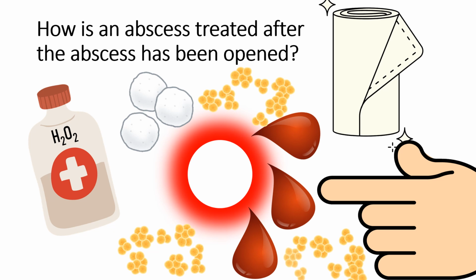Sometimes arterial bleeding may occur from the skin or subcutaneous tissue. It is stopped by suturing with catgut. Tampons are usually inserted with a hypertonic solution or dry. An antiseptic bandage is applied.